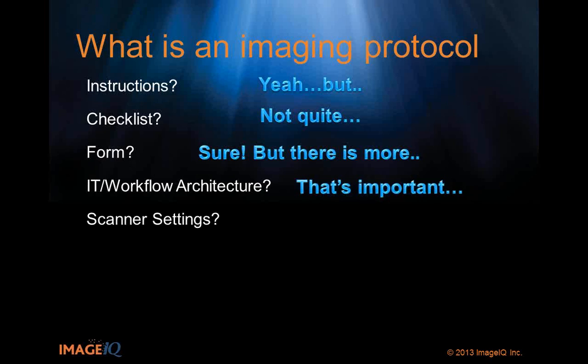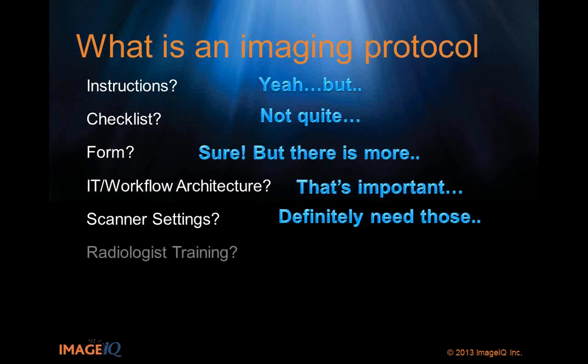Is it, and this is what a lot of folks who are especially in the more technical realm will think about, is it the scanner settings? Is it the knobs and dials and the pitch on the CT or the echo time on the MR or whatever it might be? Is it the scanner settings? Well, strangely enough, yes, you definitely need those. But an imaging protocol is more than just the scanner settings. So you're going to find, if that's all you have, you're going to find yourself in trouble. And we've seen some protocols like that.